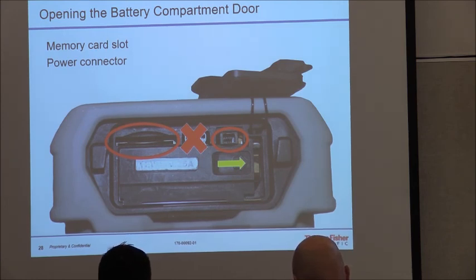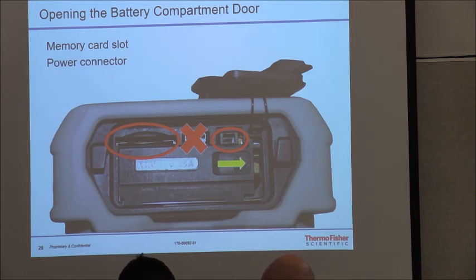Let's just say you have all the current software now, but let's just say 6 months from now we decided we were going to do a software update. The way it would work is we would send you an email. You'd get that email with one-page instructions on how to update it, and you do the memory card. You just download it to your desktop, it writes to the memory card, insert the card, and it goes through the updates automatically. Then it's literally a matter of watching the screen on the devices themselves. Okay? But that would all be on that data sheet that would come with it.